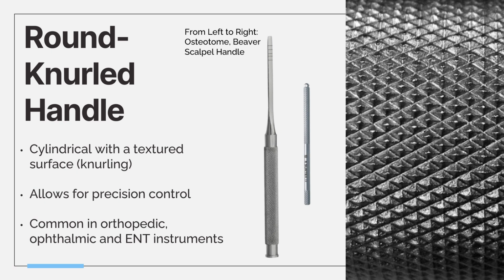So it's actually ideal for delicate procedures too, requiring fine manipulation. The round shape allows the instrument to rotate smoothly in the hand also, giving surgeons better control over angles and positioning. These patterns also require careful cleaning due to debris.